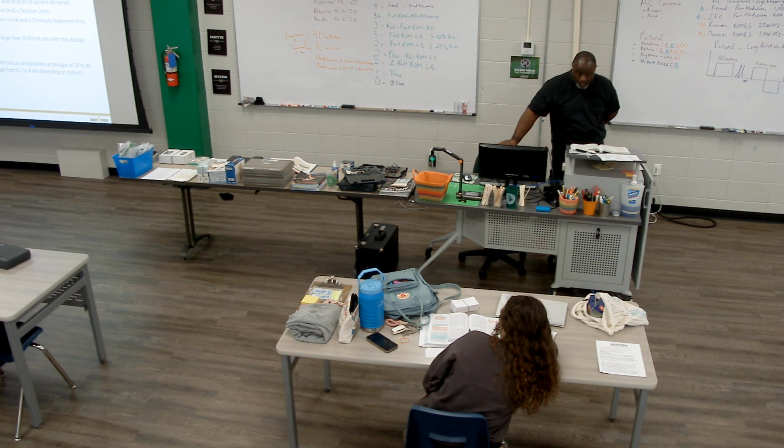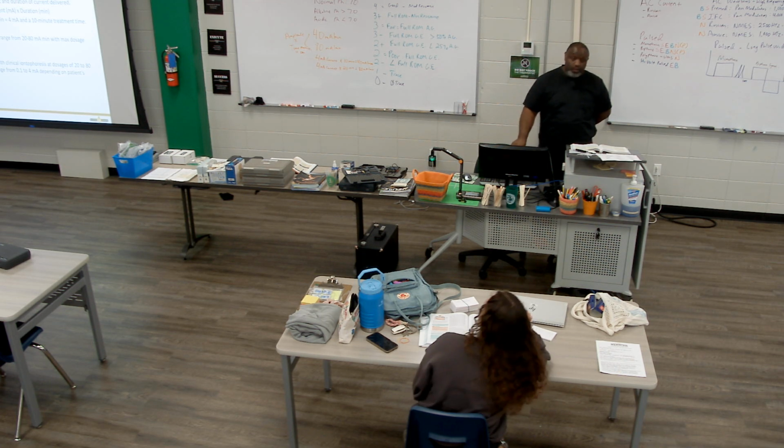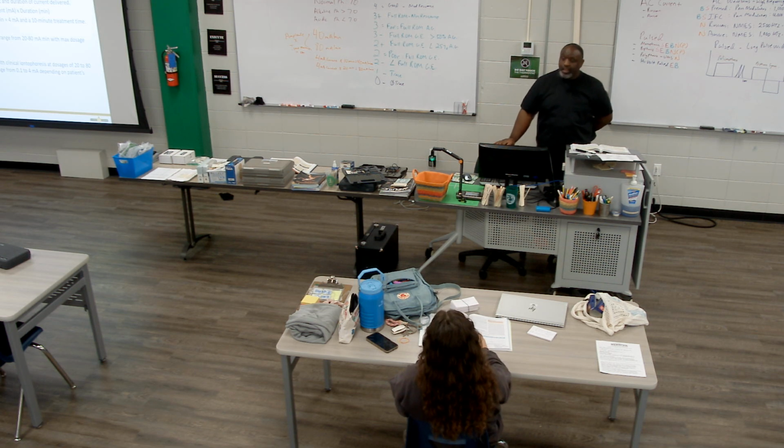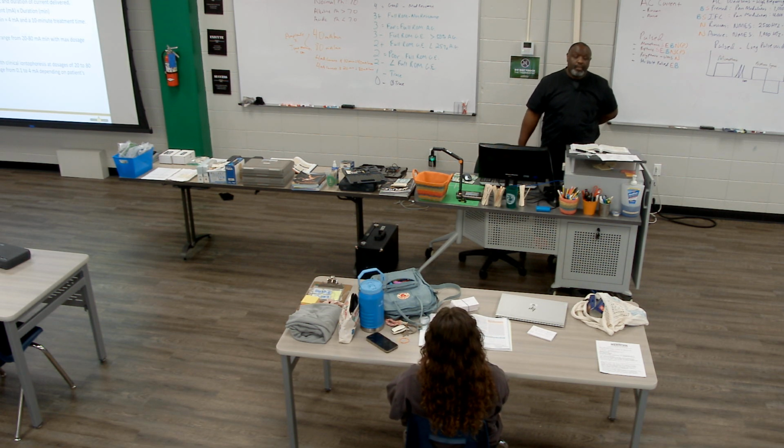Over on the right, down in the middle of the paragraph, it says the current amplitude range for all marketed iontophoresis devices is between 0 and 4 milliamps. Again, there's very few, if any, devices that will have the ability to go higher than 4 milliamps.